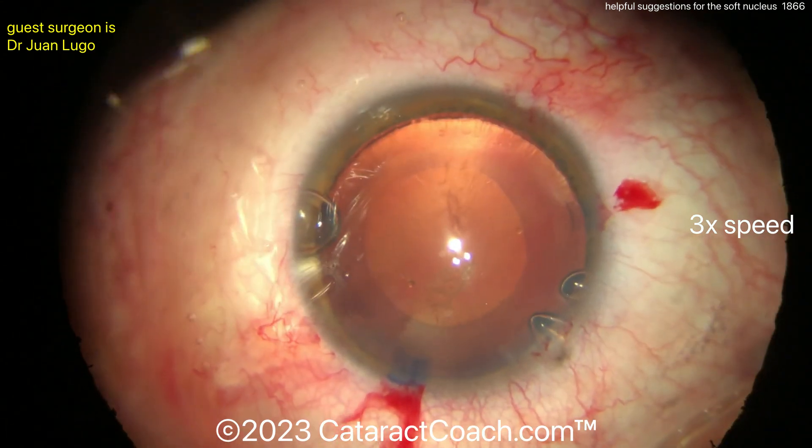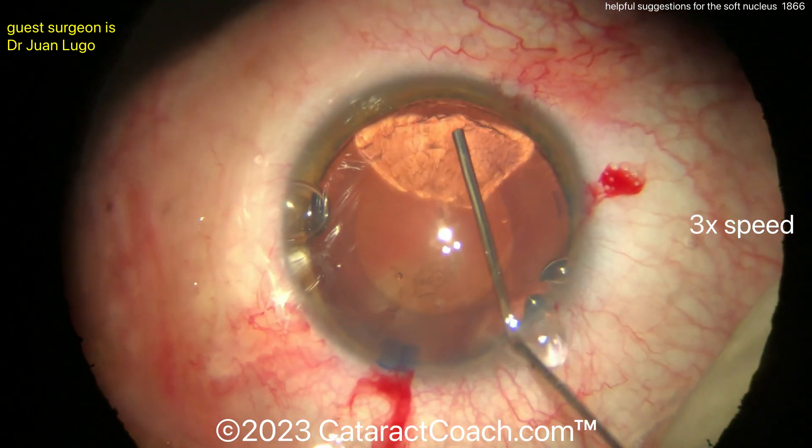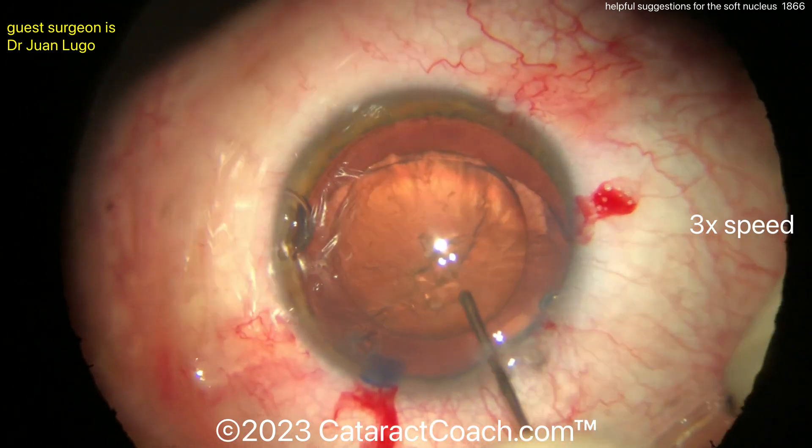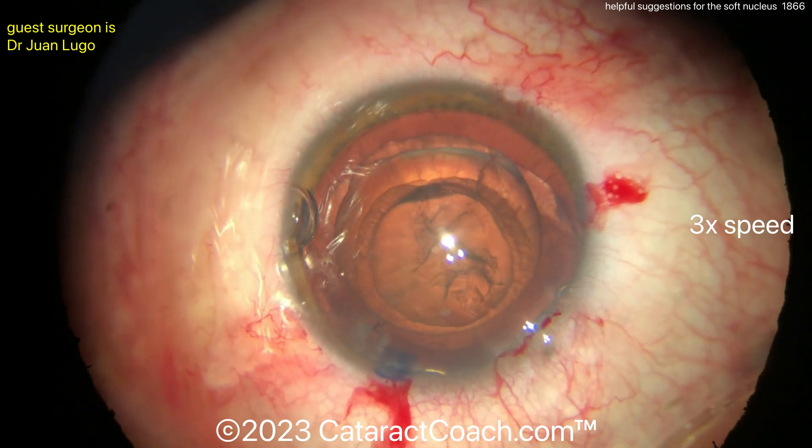That's a real nice rhexis — beautiful rhexis. Let's see some hydrodissection here. There's part of a fluid wave — there it goes, beautiful. And now the nucleus already wants to come up. So hydro-delineate — I like the idea.